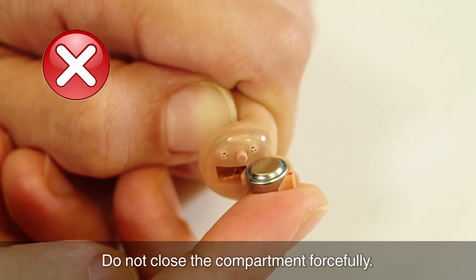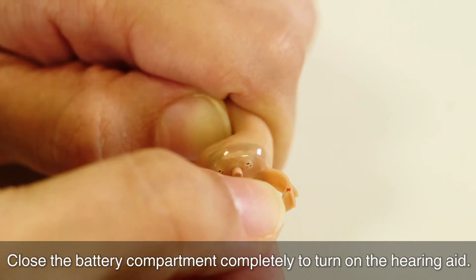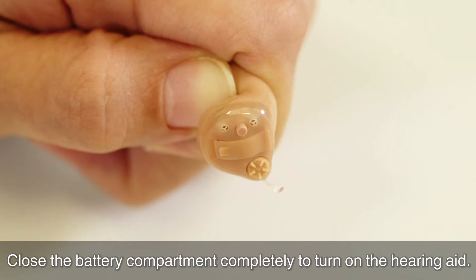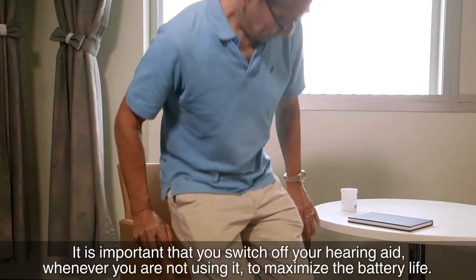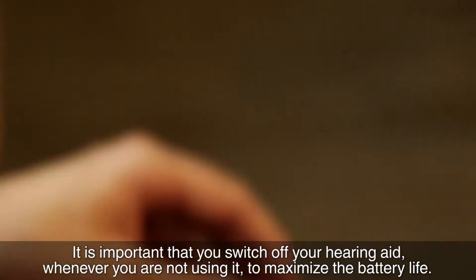Do not close the compartment forcefully. Close the battery compartment completely to turn on the hearing aid. It is important that you switch off your hearing aid whenever you are not using it to maximize the battery life.